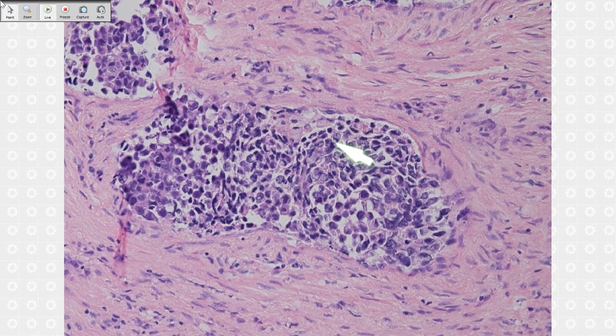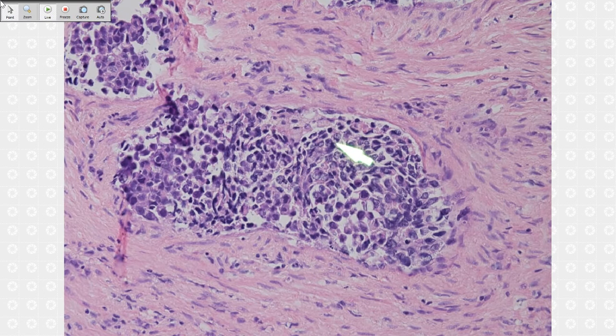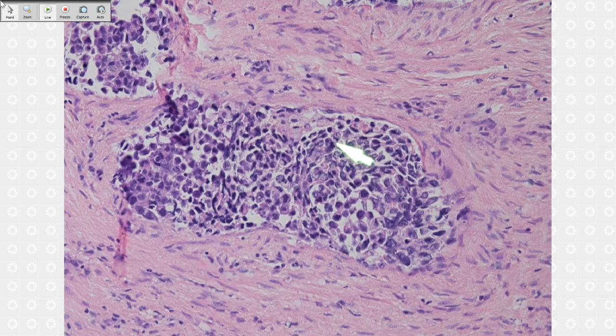You have to think this is all possibility. Of course, the patient has a CIS. When I saw this, it looked like a forming gland, cells really ugly. My major differential is urothelial carcinoma going into the prostate, or this is intraductal prostatic carcinoma, because that one is different.